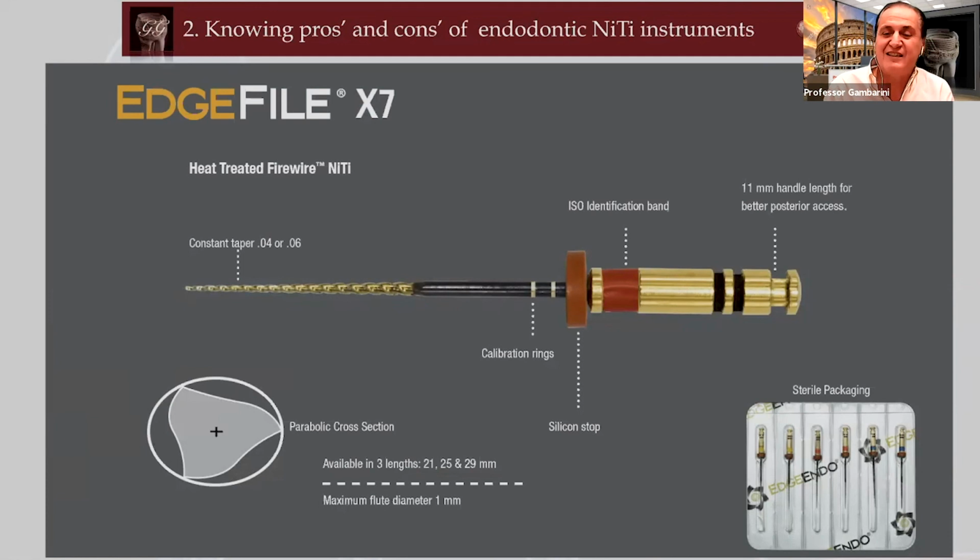Secondly, after instrumentation is over, you may have a technique that improves cleaning. In this case, I use a 3-step technique: sodium hypochlorite, EDTA, sodium hypochlorite. So three phases, and I'm using sonic or ultrasonic, but any other activation is fine. So this is my protocol.